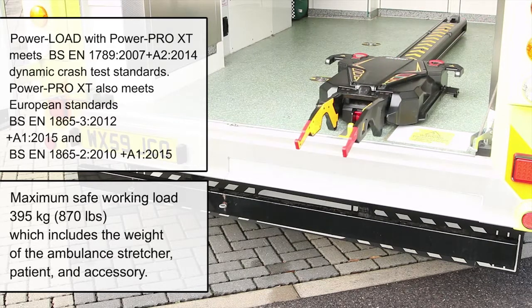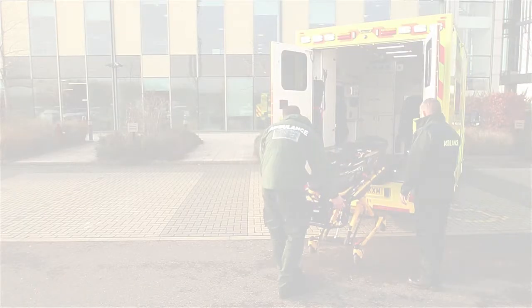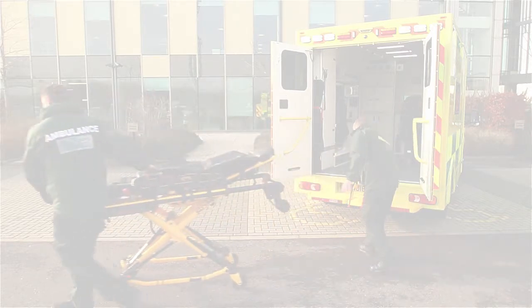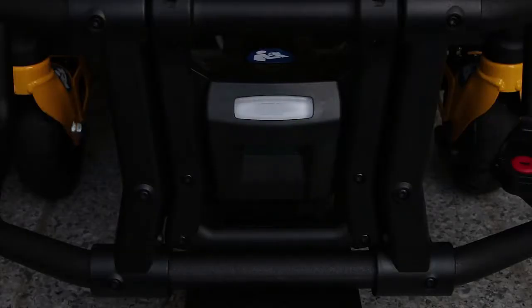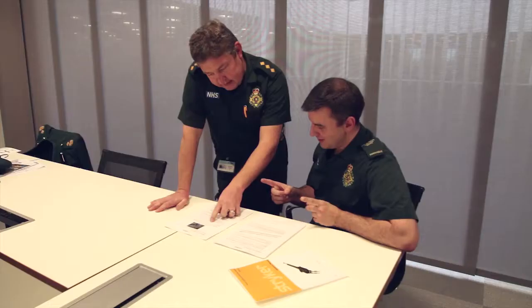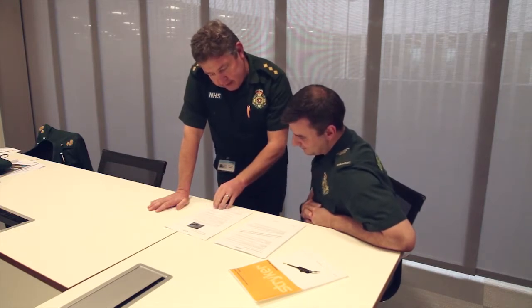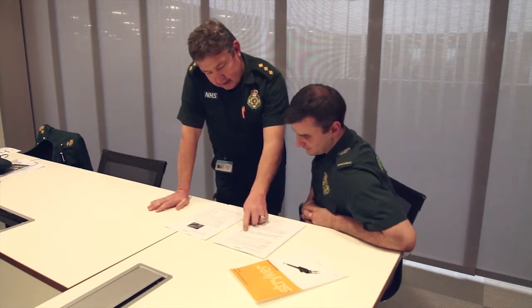PowerLoad with PowerPro XT helps to minimize the risk of patient drops by supporting the stretcher until the wheels are on the ground. There is only one operator required for an unoccupied stretcher and two operators for an occupied stretcher. Make sure the battery is fully charged before first use and before training. Have a qualified person use the checklist and operation instructions in the Operations and Maintenance Manual to check PowerLoad functionality.